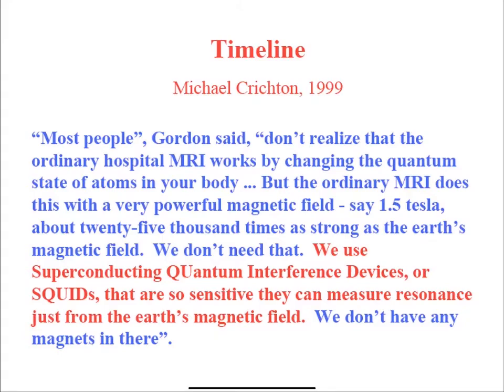And the idea is, the reason for the big magnet was to get that net magnetization. And the bigger the magnet, the bigger that magnetization was, so that we have a bigger signal to detect. The idea is with a very low field magnet, you still have a magnetization, but it's very small, so your signal level is very small. But if you have a very sensitive detector, then maybe you can measure something that's useful. So that's the idea behind using squids.